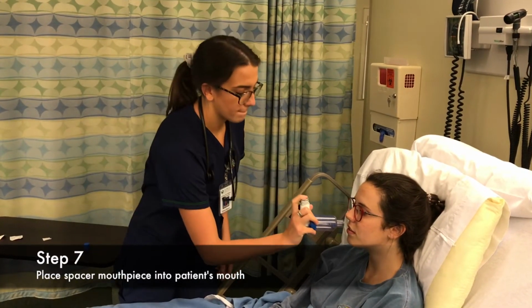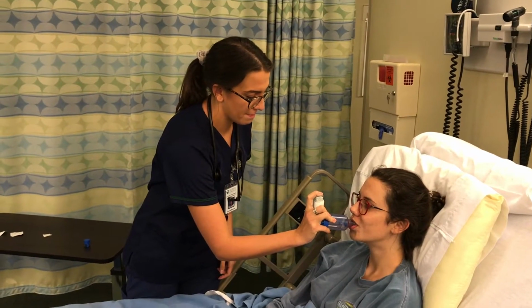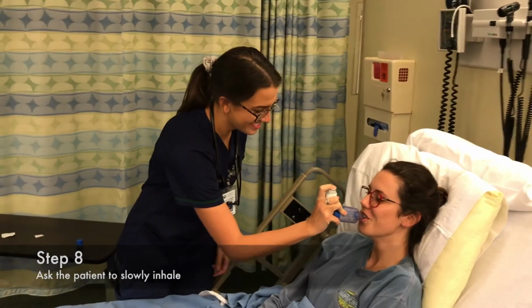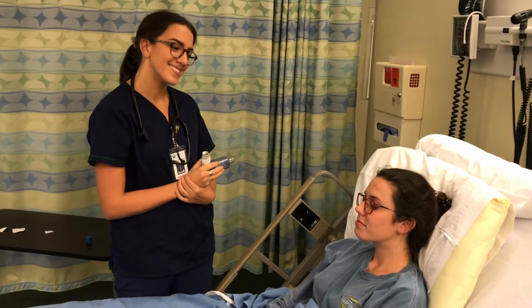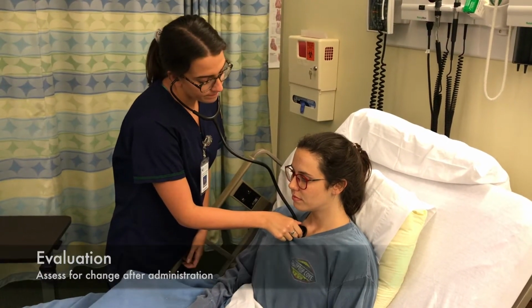Place the spacer mouthpiece into the patient's mouth and have her seal her lips around the mouthpiece. Ask the patient to slowly inhale and then hold her breath for as long as possible. Assess for change in respiratory status after medication administration.